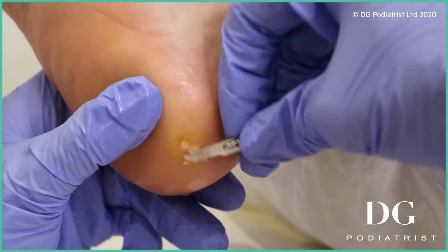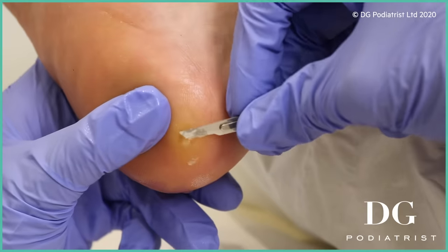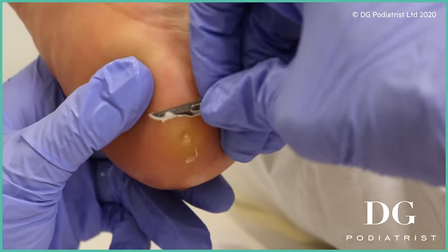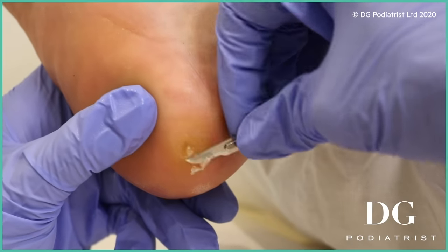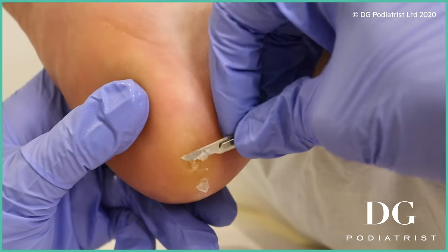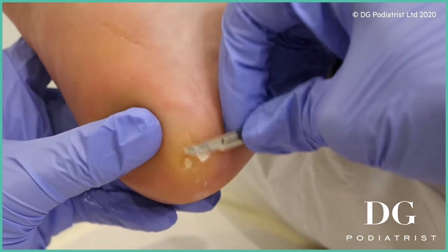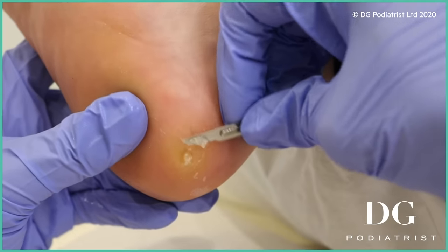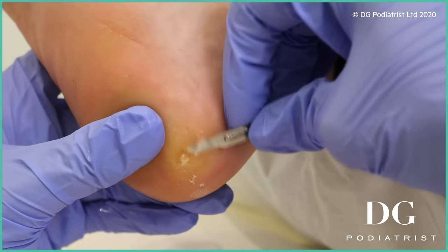Just checking to see how painful it is on that side. And when's the last time you tried to do something at home — what would you normally do? I tried to remove it with home methods but I couldn't do anything. And you told me it's not good to do it at home; I was looking for someone professional. Yeah, it does help. You're on your feet quite a bit for work, aren't you? Yes, and comfortable shoes — so people need to think about their shoes.